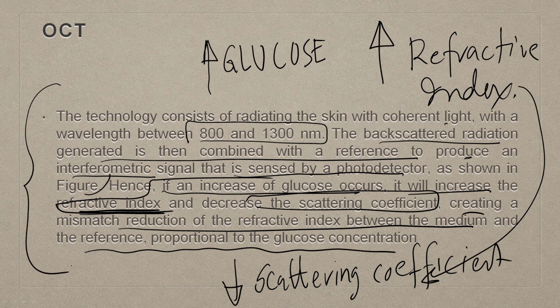This is in principle the basic way of understanding optical tomography for glucose detection.